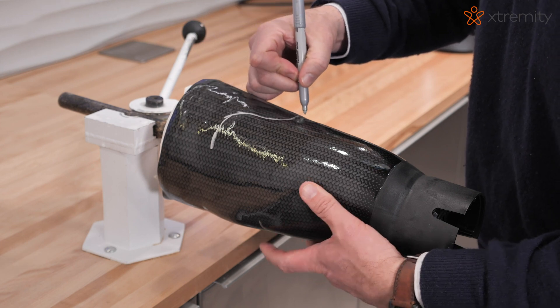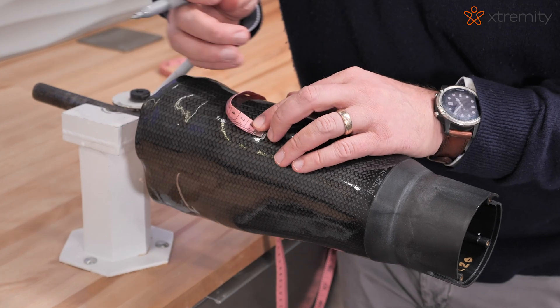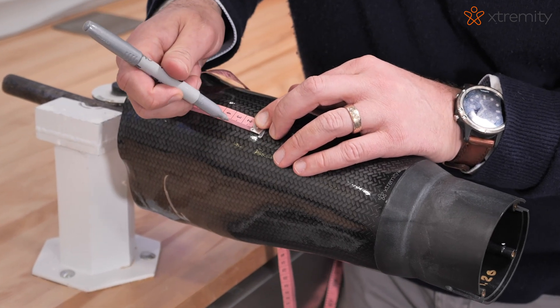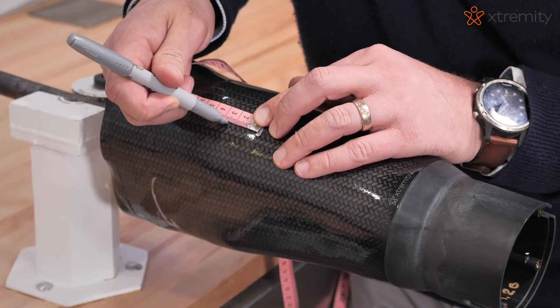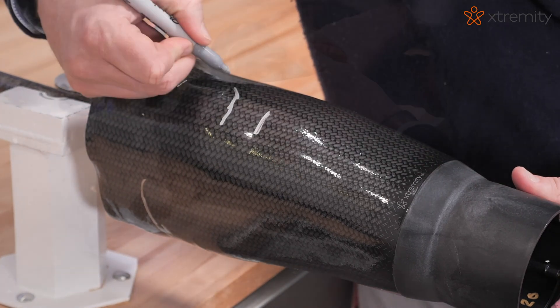Once cool, remove from vacuum and draw trim lines. The extremity TT requires an anterior trim line of 2.5 cm proximal to MPT to maximize socket strength and maintain warranty.